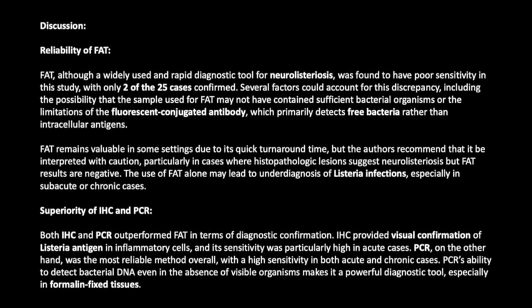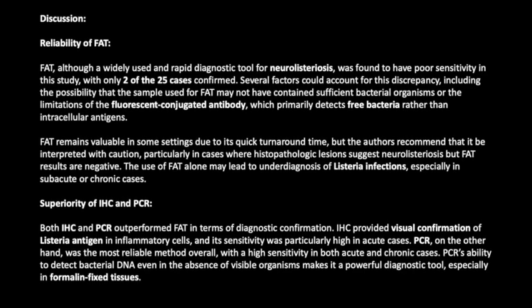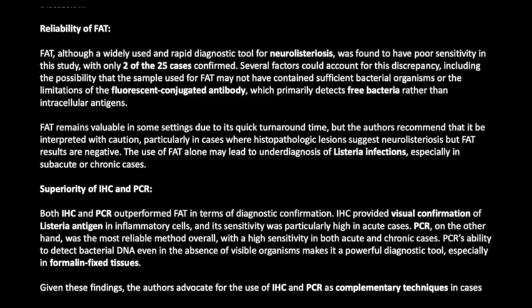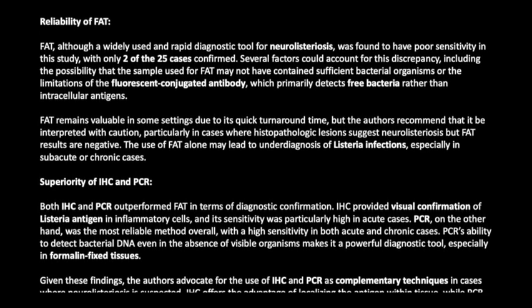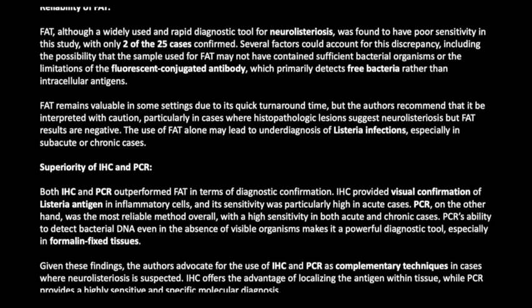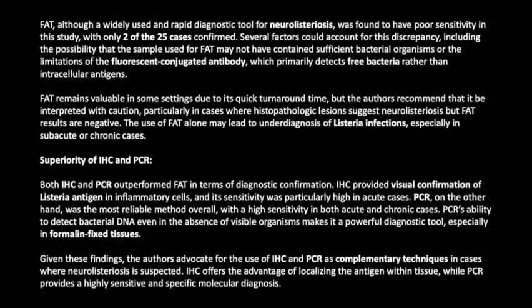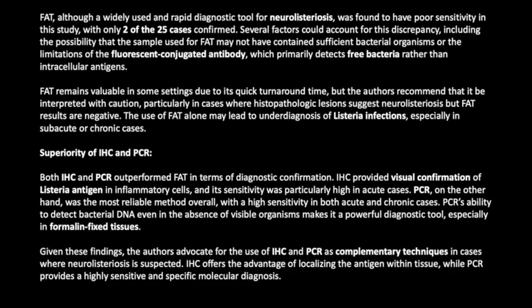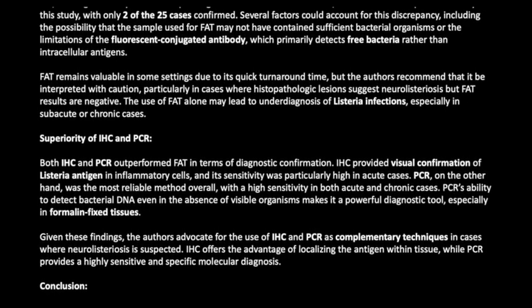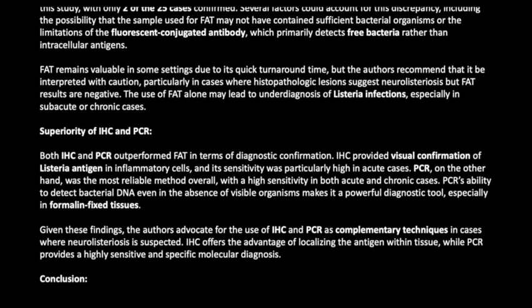Superiority of IHC and PCR. Both IHC and PCR outperformed FAT in terms of diagnostic confirmation. IHC provided visual confirmation of Listeria antigen in inflammatory cells, and its sensitivity was particularly high in acute cases. PCR, on the other hand, was the most reliable method overall, with a high sensitivity in both acute and chronic cases.